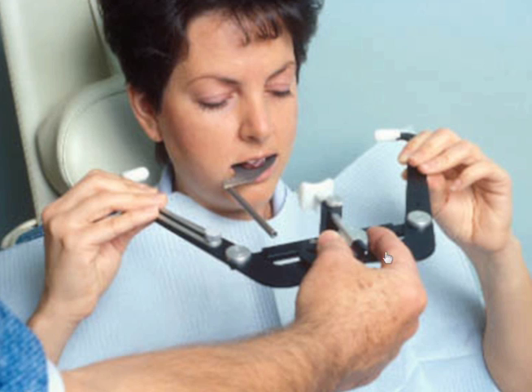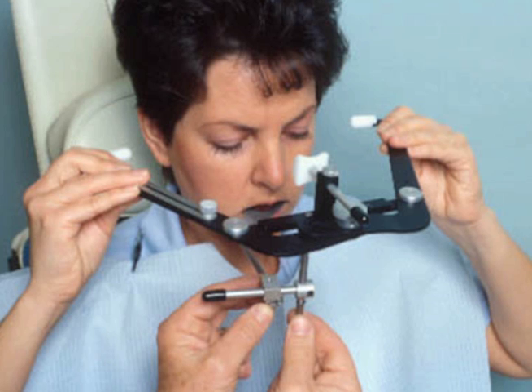We can then come in with the Facebow where we loosen the large screw here in the front and we instruct the patient to put the earplugs in their ears, sort of like a stethoscope or maybe the earphones of their radio. And while they're doing this, we can go ahead and slide the double clamp over the bite fork stem here.